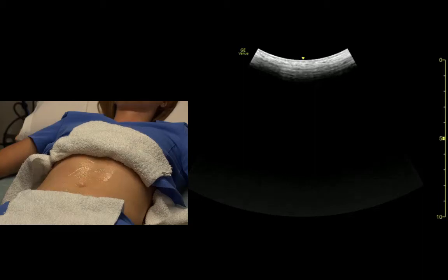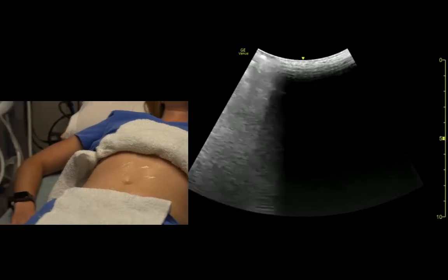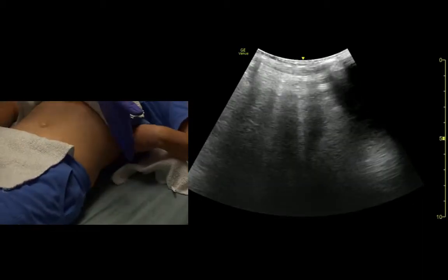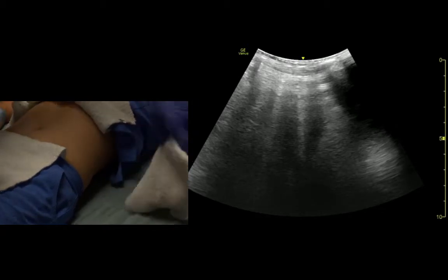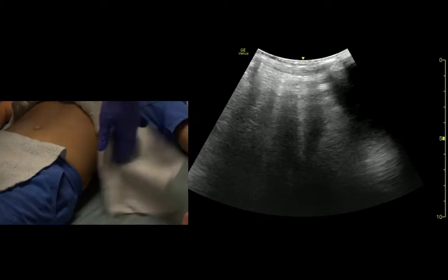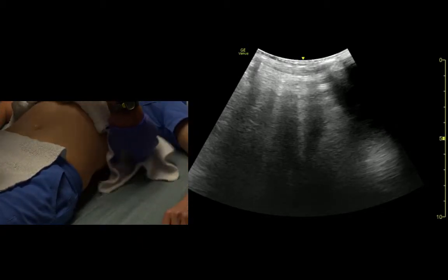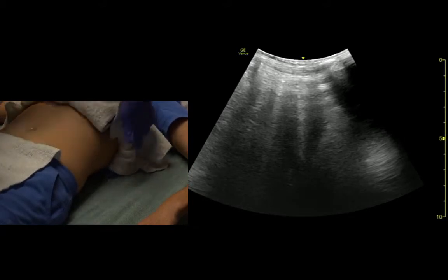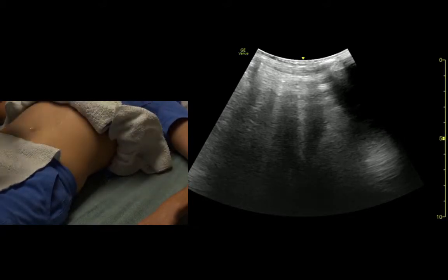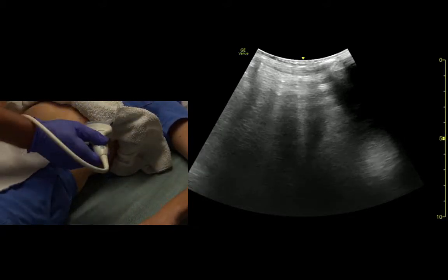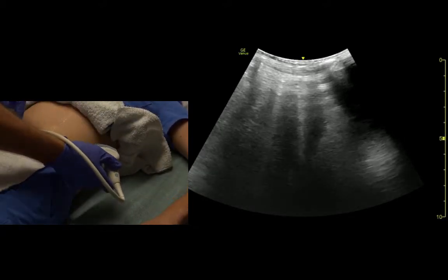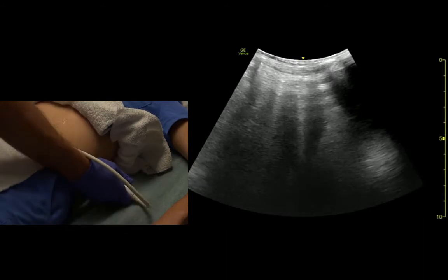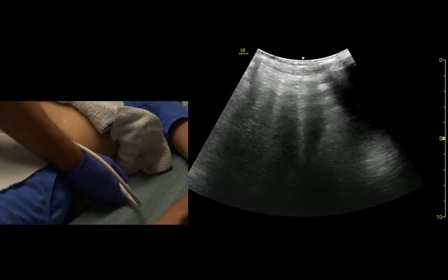Now I'm going to come over to the spleen, the left side. We come pretty much across from the xiphoid. The indicator is at about 1 or 2 o'clock. Almost back, hand on the bed.